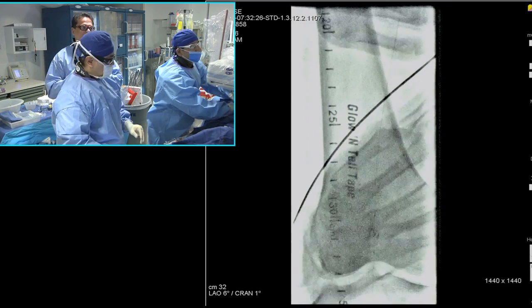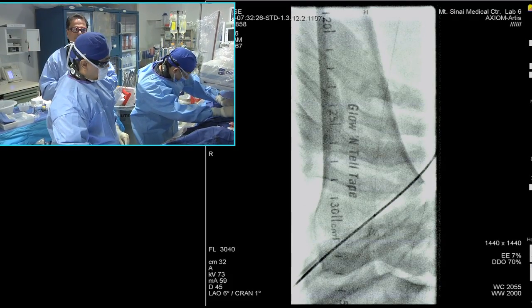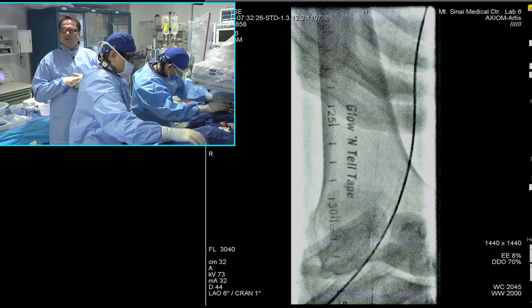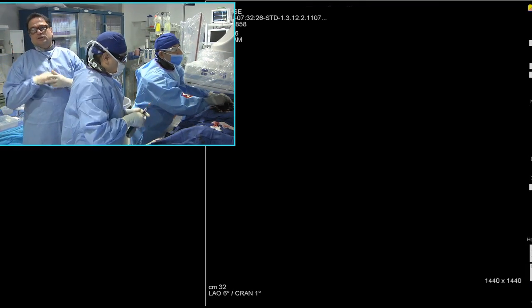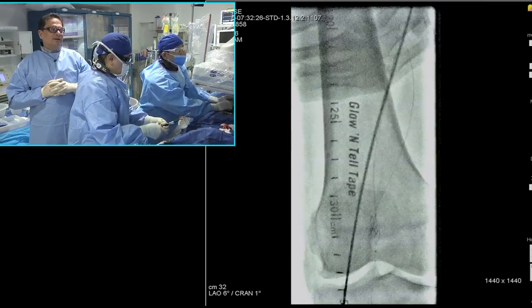We've also submitted another paper recently looking at the utility of IVUS, and we're waiting to hear back in identifying these cuts. Hopefully that will also get into one of the journals, so this way we can also add to the literature on that. But I really believe that in these long segment lesions, adjunctive therapy, especially with calcium or just heavy plaque burden, is going to make a big difference.